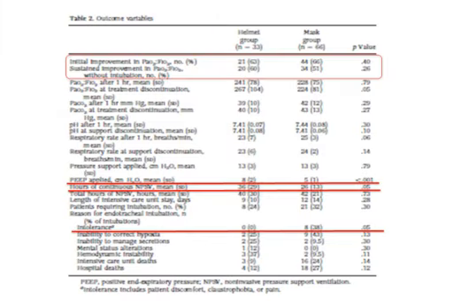And as I told you, we didn't know a lot about the physiologic characteristics of the helmets, but we noticed that the helmet group was ventilated with a significantly higher PEEP, 8 centimeters of water, compared to 5 centimeters of water. This PEEP is nowadays considered the minimum level of PEEP that we have to apply in the helmet to improve helmet performances. And then the helmet patients were ventilated continuously for a longer time compared to the mask patient group.